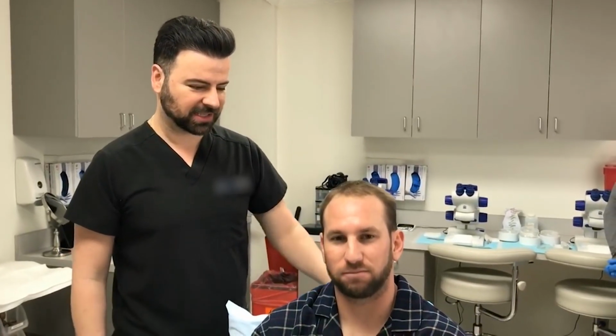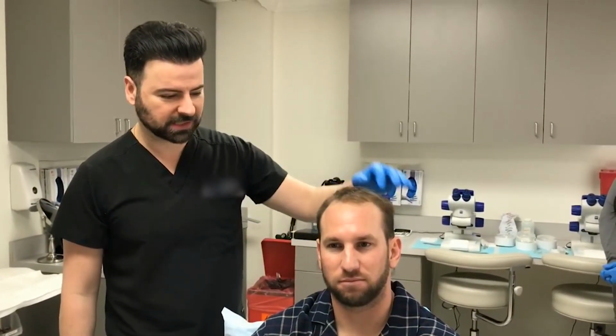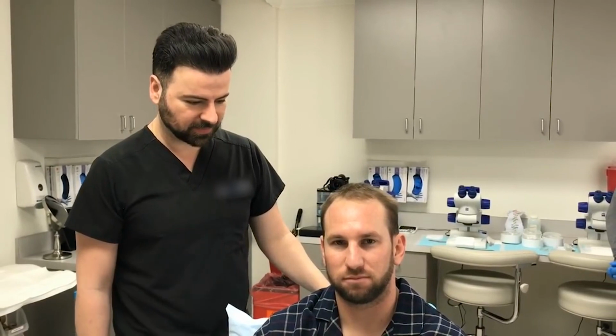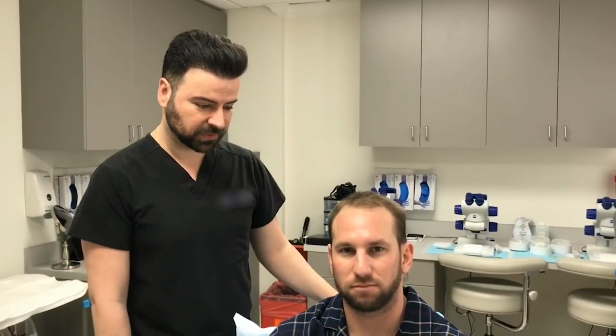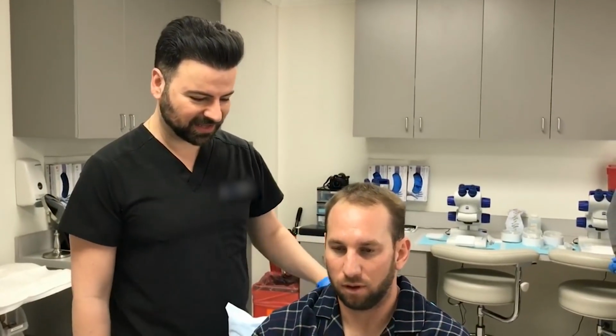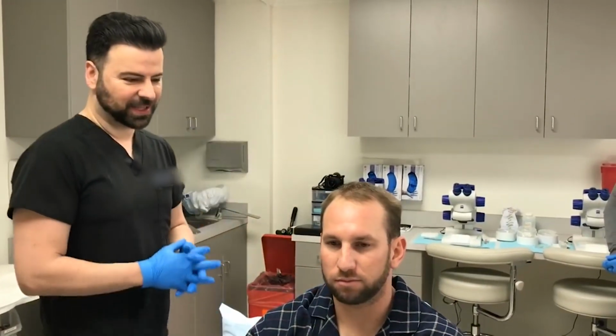Chad. Chad is coming in so we could reinforce his hairline and add density. We're aiming roughly around 2,500 to 2,700 grafts for Chad. How's your day? You're excited? Looking forward to it? I am. You ready? Yes, I am.